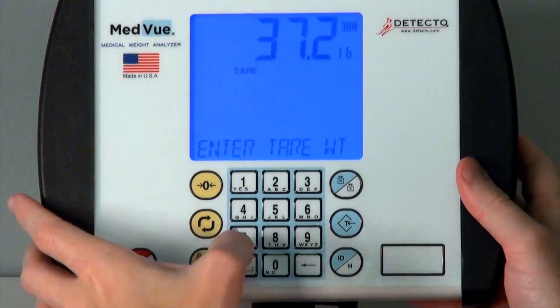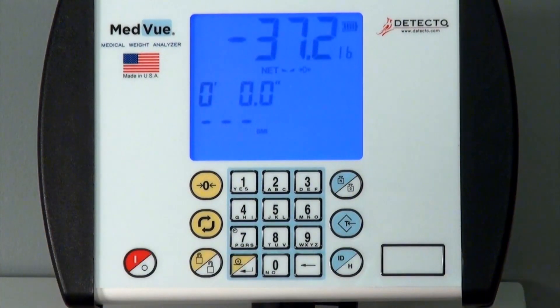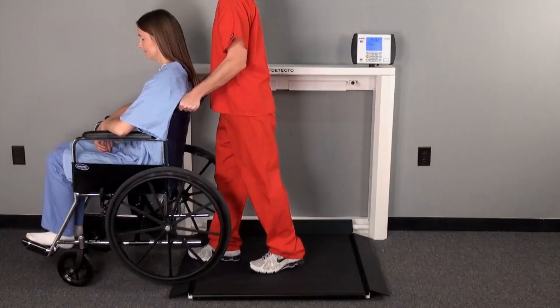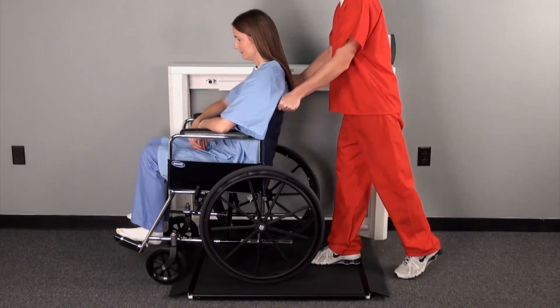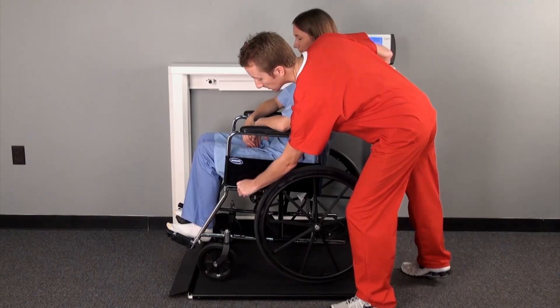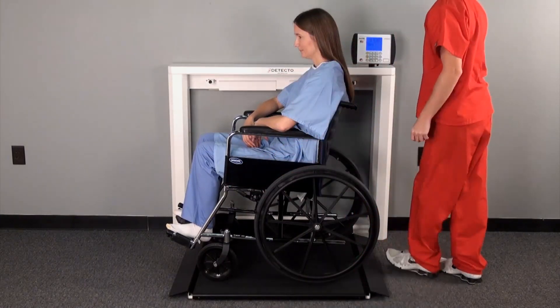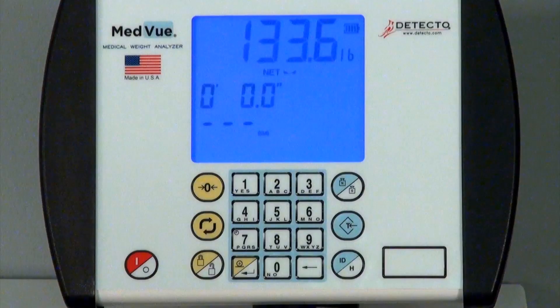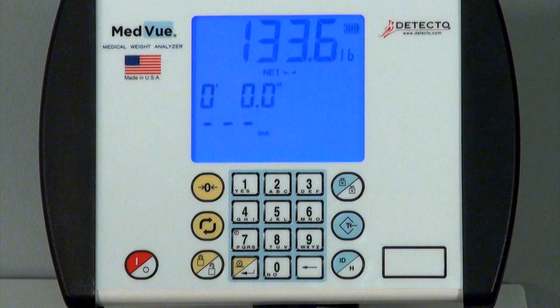The display will then change to a negative weight value and the net enunciator will toggle on. You may now roll a wheelchair patient onto the scale and read their proper weight measurement. The weight of that wheelchair will have been removed from the readout and you will be able to accurately view the patient's weight.